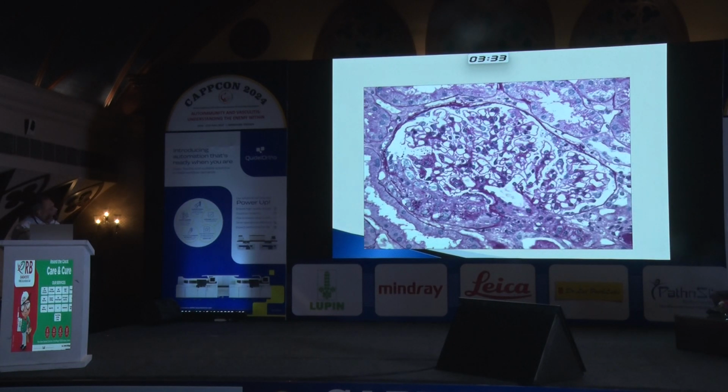This is another section where we took several cuts, and usually when I see a kidney biopsy, I take around 16 to 20 cuts from a single core, so that I study it at different levels, what's known as the Z-axis. So once you go from pole to pole in the sections, you find that the morphology changes, and that's how you should evaluate a kidney. You should look in all the 4 compartments with all the 4 stains.